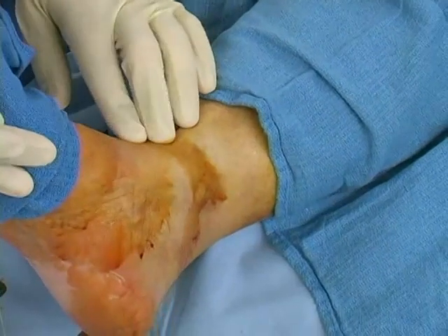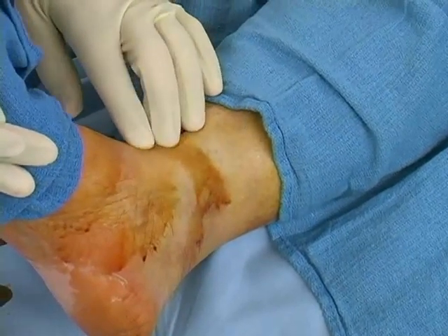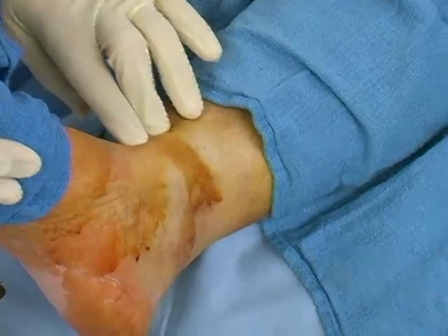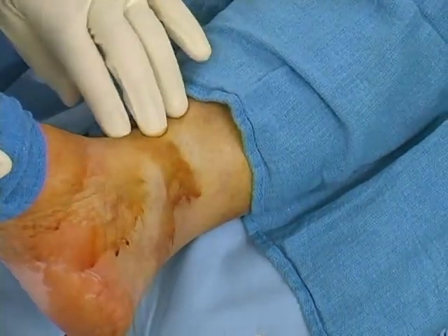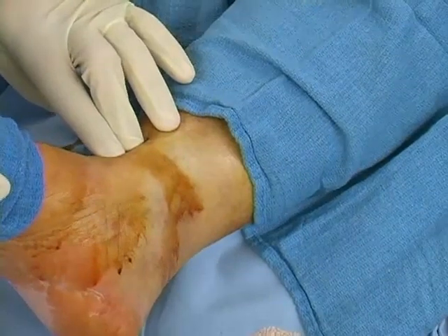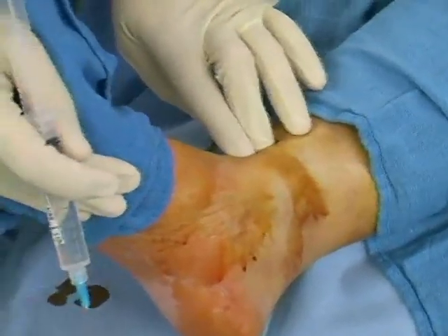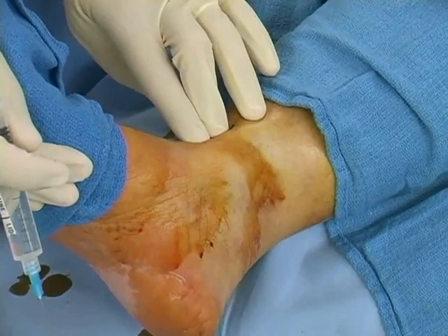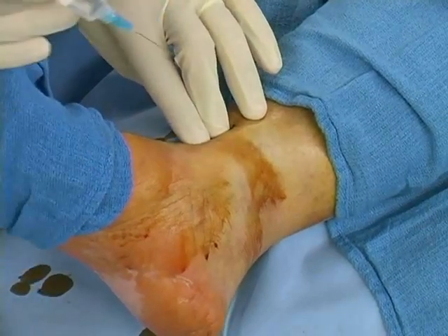Dorsiflex the patient's foot to locate the extensor hallucis longus and the extensor digitorum longus tendons. The deep peroneal nerve lies between these two tendons before dividing into its medial and lateral branches. Feel for the dorsalis pedis pulse. The nerve is located lateral to the artery.